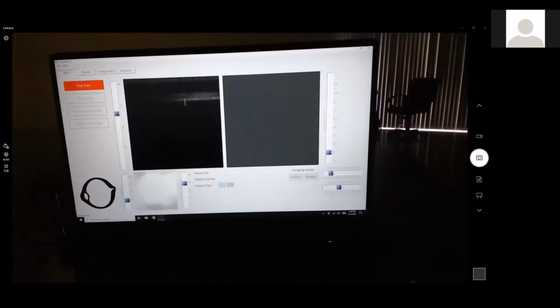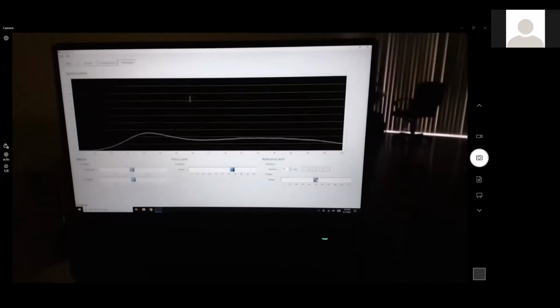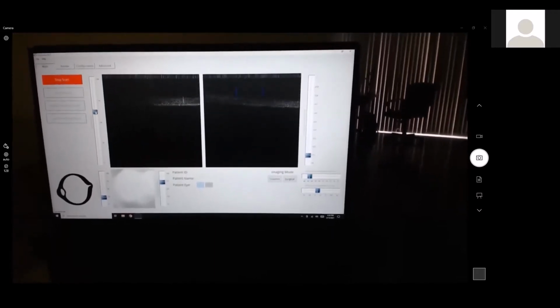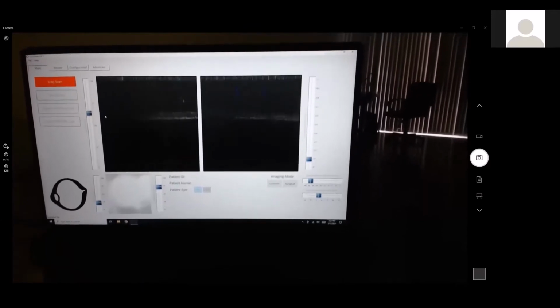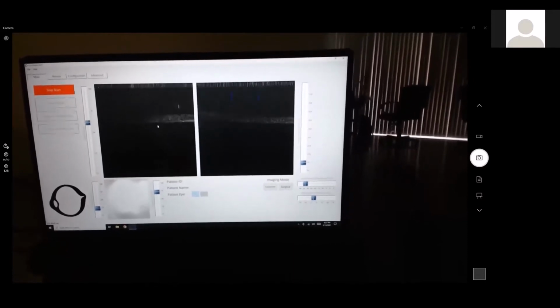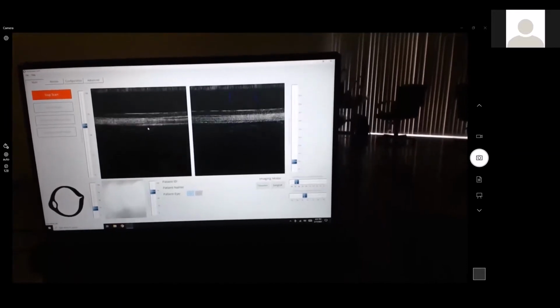Let's go back to cross now. It's okay? Yeah. There we are.